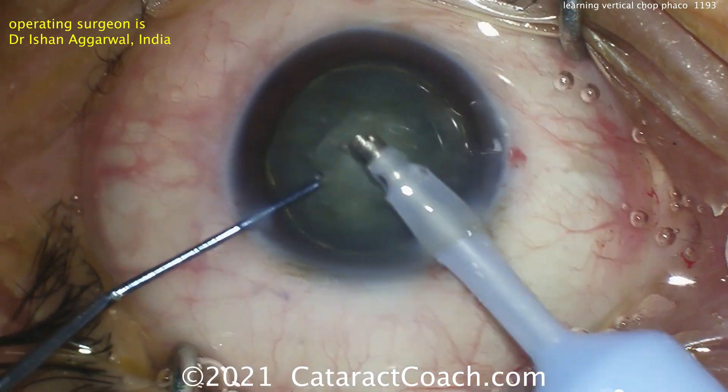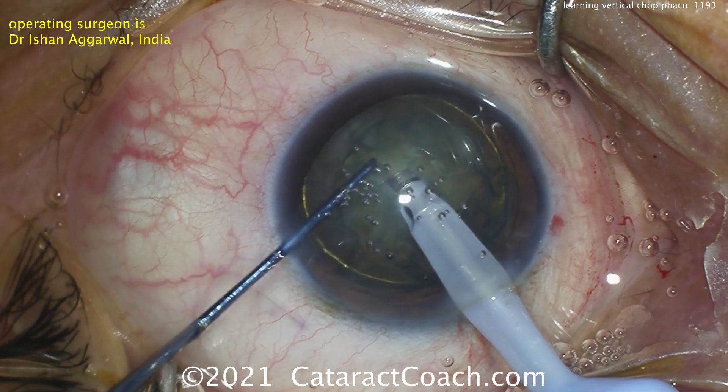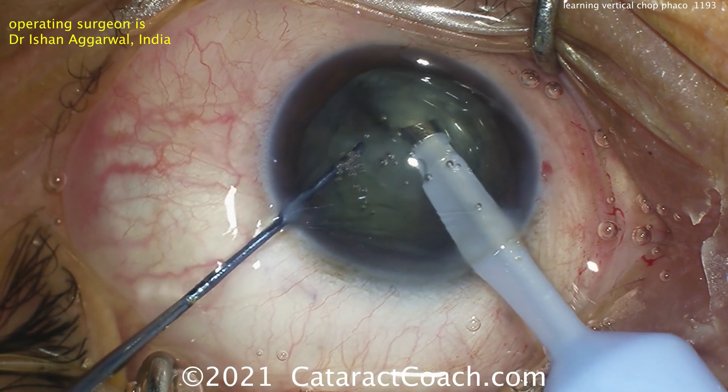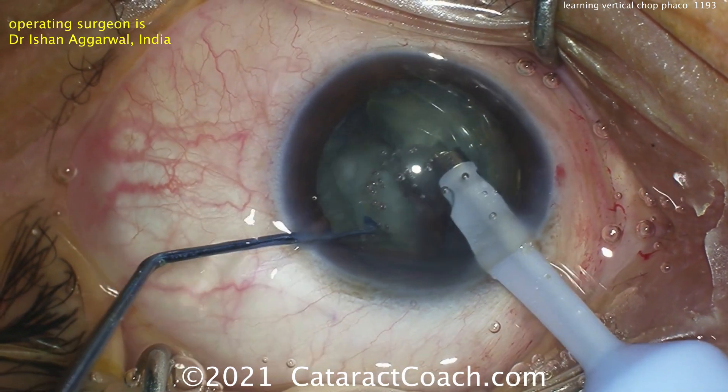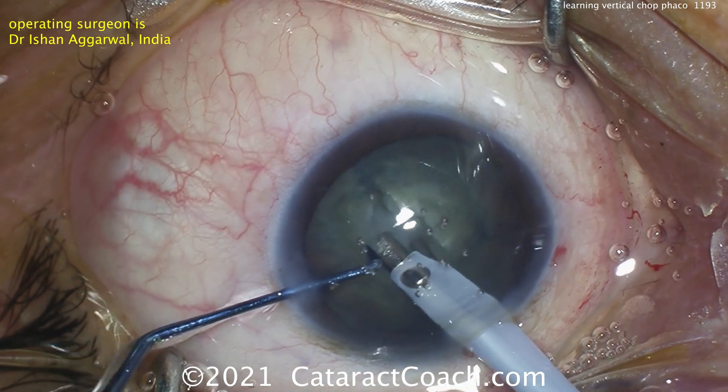A little problem there with some air bubbles. Let's try that again — buzzing in here, and the chopper can be placed now and then just going downward. It's a vertical motion, hence vertical chop. And like that, the nucleus has been split into two halves.